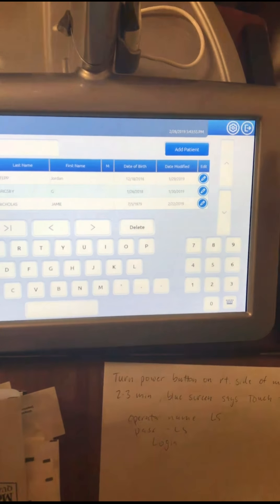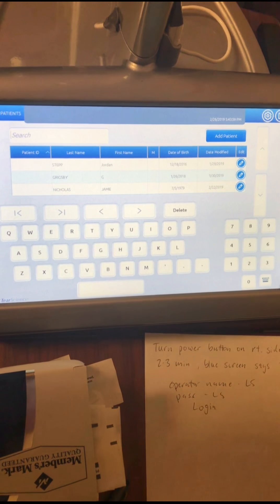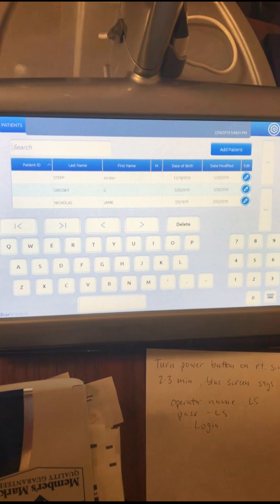There's a power button on the side of this monitor, over here on the edge. You turn it on. After it's been on for a few minutes you're gonna see a big blue screen and it'll say touch to continue.